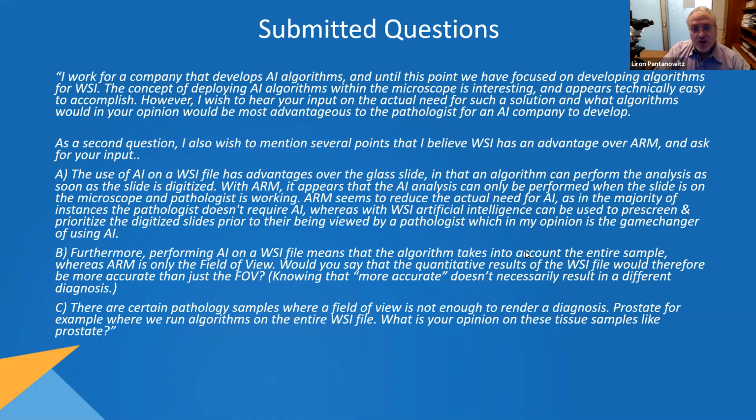And I think that with ARM coupled with AI, probably the best solution we have now. For example, if I have a case of breast cancer that has extensive DCIS and only a small area of microinvasion, I'll bet that there are very few AI algorithms now that will get that right every single time. Exclude all the DCIS, diagnose that and grade that, and then find the small area of microinvasion amongst that, and then separately grade that. So if you're going to try and implement a system to accomplish that, you need a highly sophisticated AI algorithm, and I doubt you would get 100% performance on that.